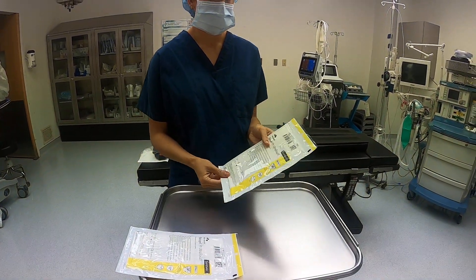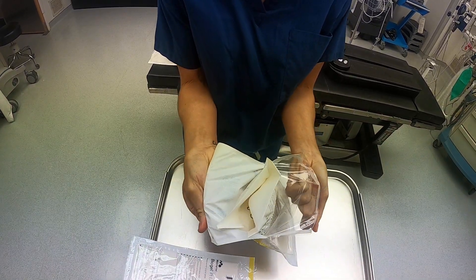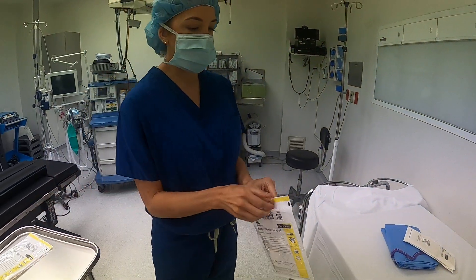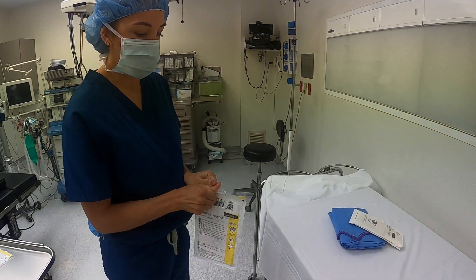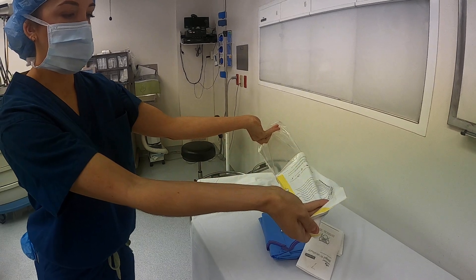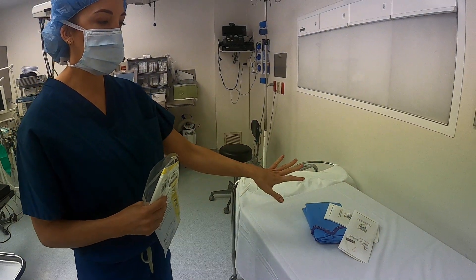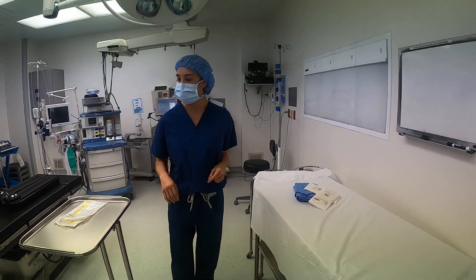Gloves are next. From the top, grip both sides well and start peeling. You've got your sterile gloves inside — open them up just like a flower. As you expose them, flip and drop directly onto the table. Be careful not to start ripping from the wrong angle, which can drop the glove. Don't start opening the glove and then try to toss it across the table. Just slowly, slowly over the table, let it drop. It's okay to get close to the table as the gloves drop — better that the glove lands on the table than to toss it and miss. Now you have sterile gloves and a sterile gown open on your field, and we'll show you how to self-gown and self-glove once scrubbing is finished.